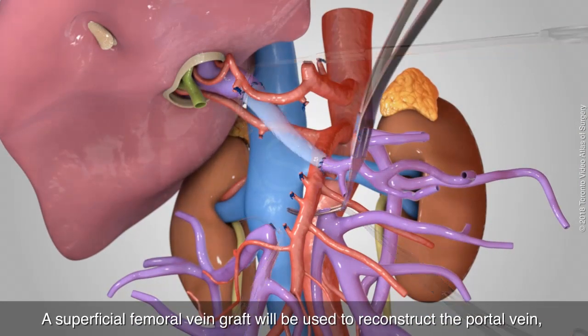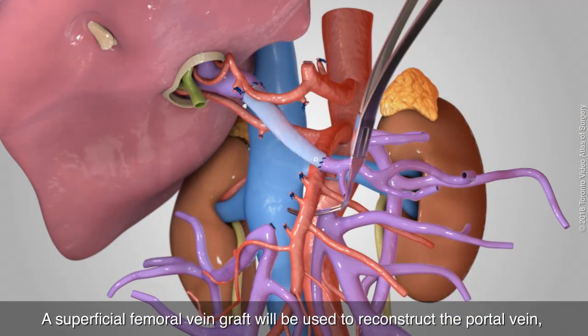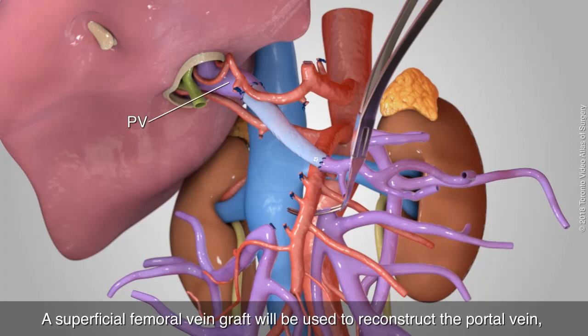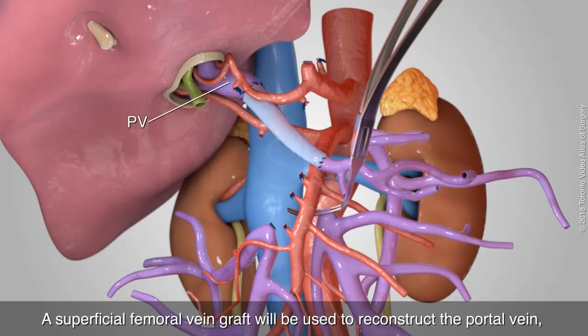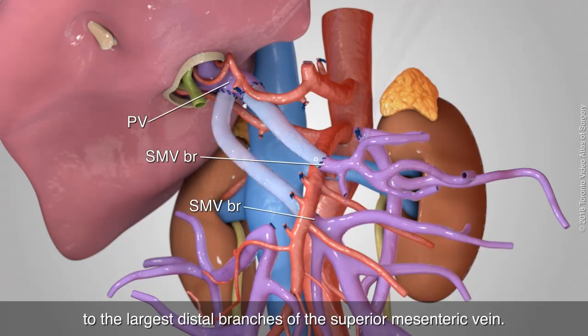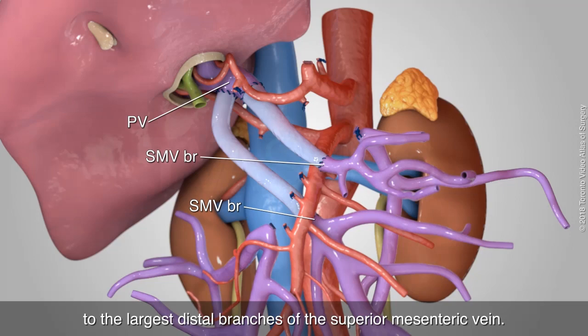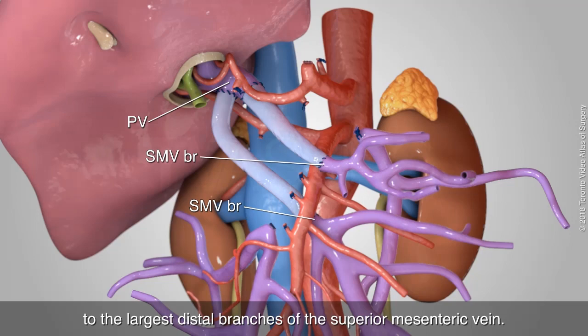A superficial femoral vein graft will be used to reconstruct the portal vein to the largest distal branches of the superior mesenteric vein.